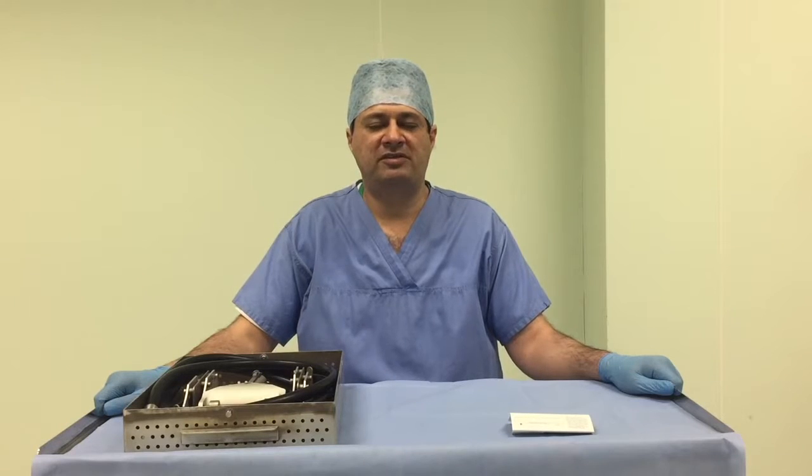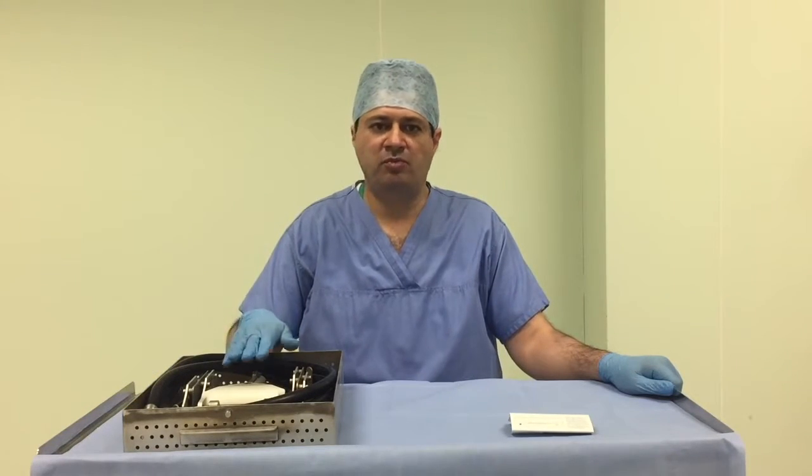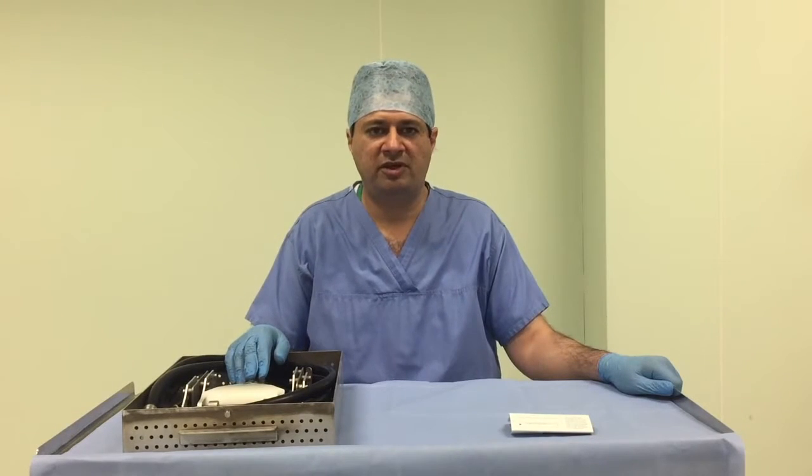Hi, I'm Umey Rambo. I work for the plastic surgeon and bones consultants in Yorkshire. Today I'm going to be talking to you about the pneumatic dermatome, its various components, how to put it together, and the safety precautions while doing that.